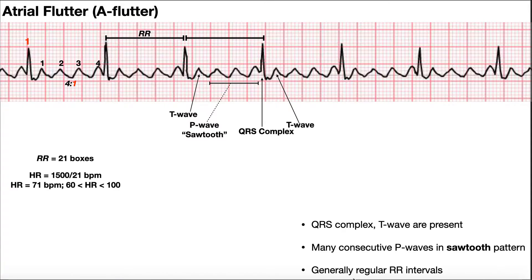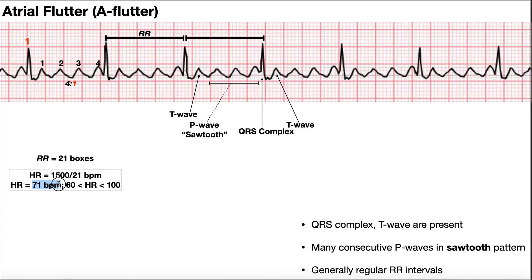Generally with atrial flutter, there's going to be regular R-R intervals, although there does not have to be. This is one example where they are regular, and if they are regular, we can do our typical way of calculating heart rate. So we can count the number of small boxes between two R's. We count over — I've got 21 here. So we take 1500 divided by 21, and that gives us our heart rate in beats per minute: 1500 over 21 is 71 beats per minute.